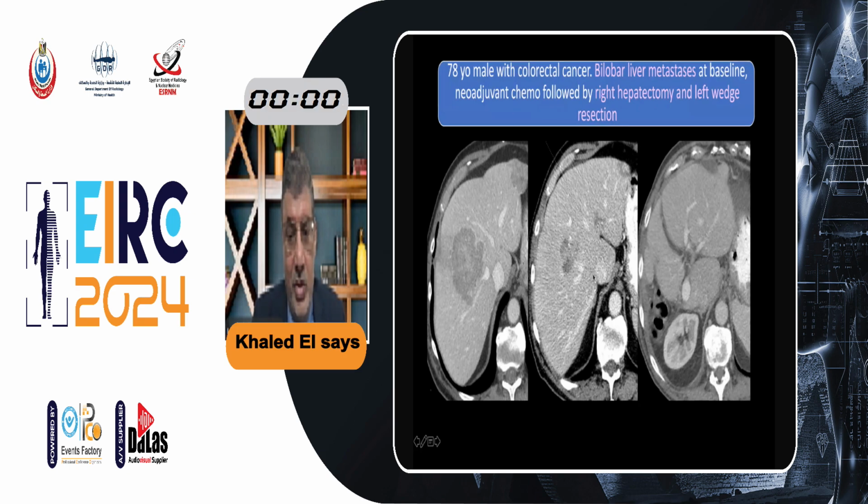So here they did portal vein embolization of the right liver since they plan to have the left liver function take over.